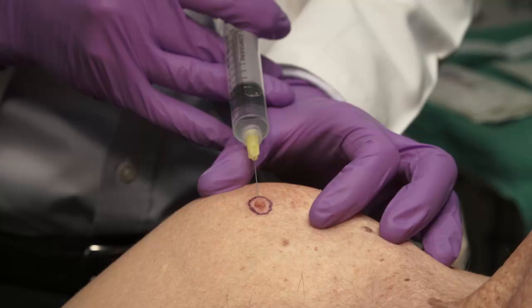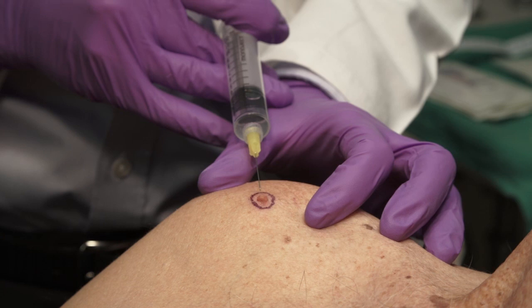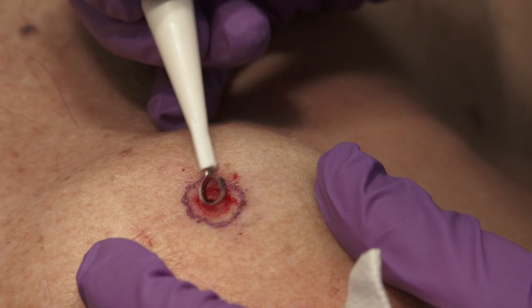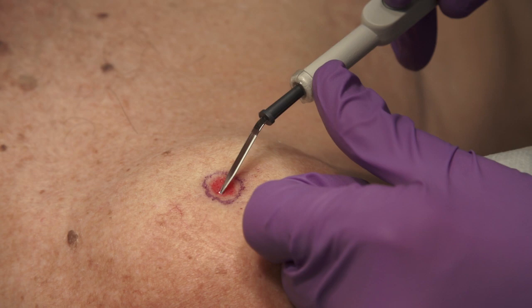A squamous cell carcinoma in situ was diagnosed with a shave biopsy at the previous visit. The procedure begins with local anesthesia using 1% lidocaine and epinephrine. Curettage is performed using a 7mm disposable curette in all directions, making sure to clear any remaining tumor from the edges. Electrodesiccation is performed using a blunt-tip disposable electrode with a power setting of 16 watts on low.